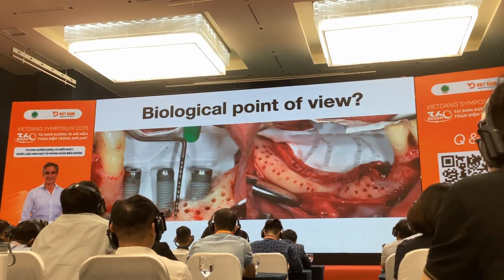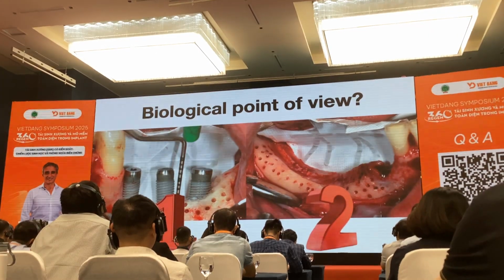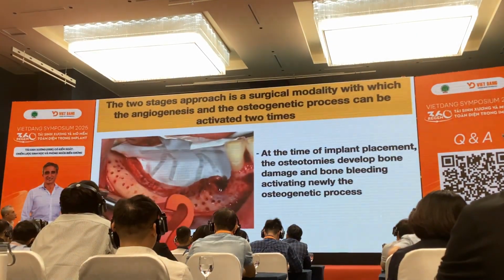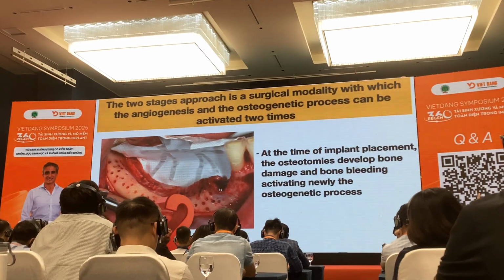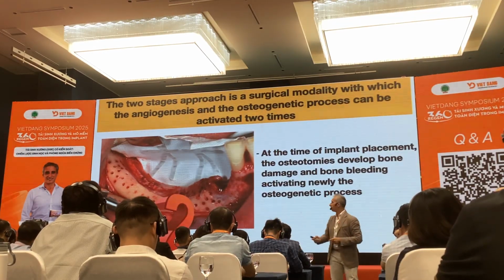Biological point of view, 1 or 2? 2. The best from the biological point of view is a 2 stages approach. Why?